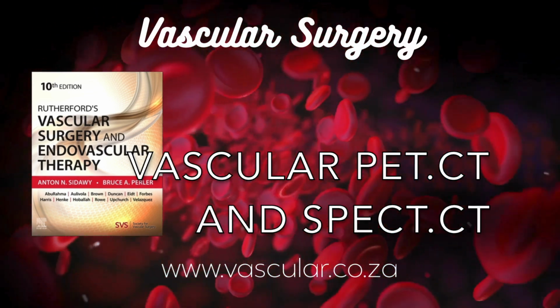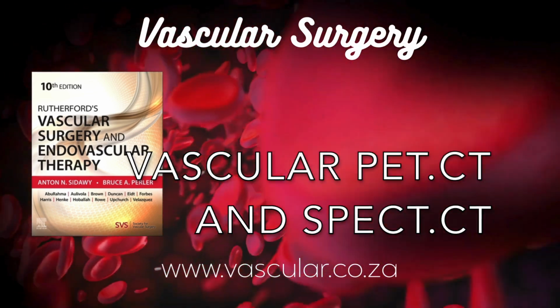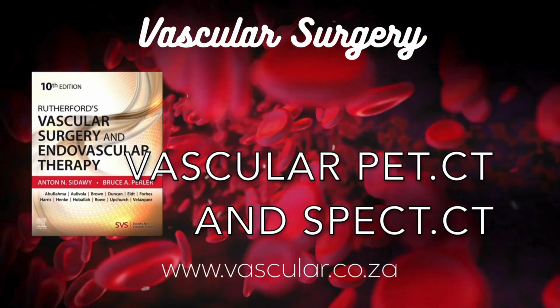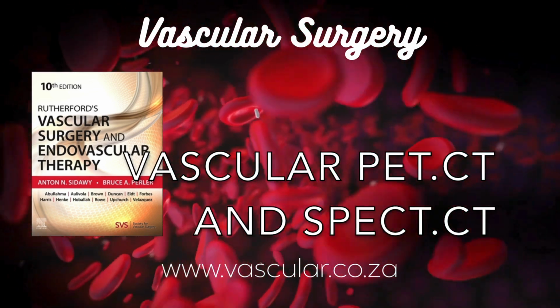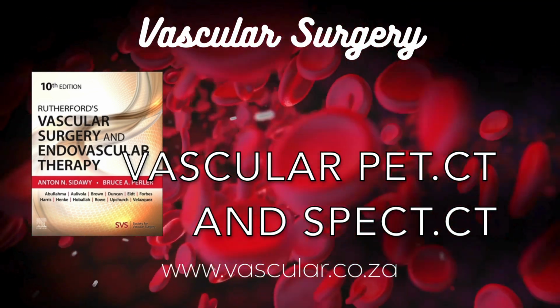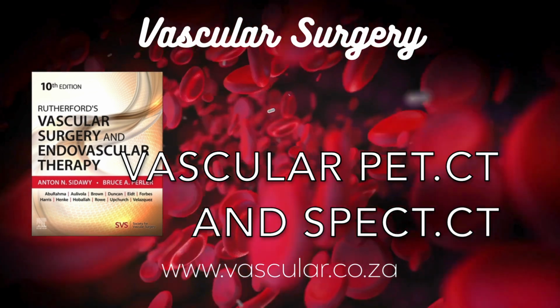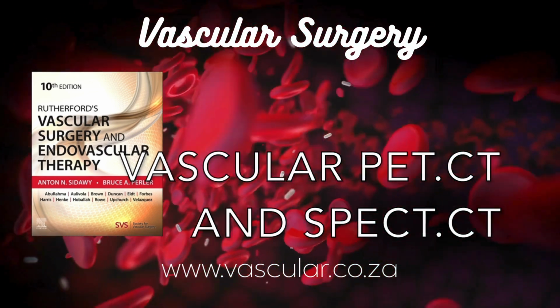Exactly. And the other huge development, just starting to roll out, is total body PET/CT. Total body, scanning the whole person at once? Essentially, yes. These new scanners have detectors covering a much larger area, sometimes the entire length of an adult. This is potentially revolutionary. Also, they can scan much, much faster. Or alternatively, they can scan for the same amount of time but use significantly less radioactive tracer, lowering the radiation dose dramatically. Or they can track tracers over much longer periods, hours even, to see slow biological processes. And they might even achieve better spatial resolution.